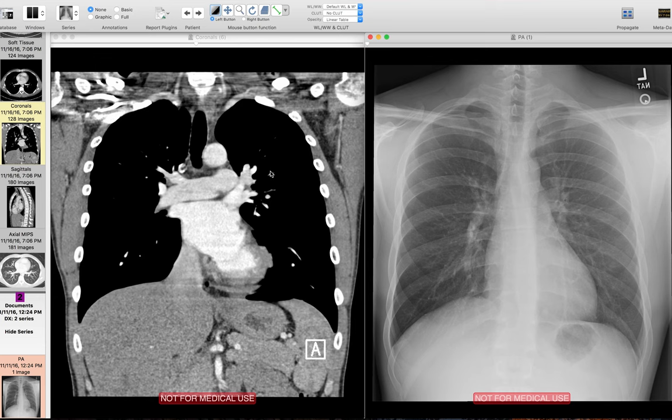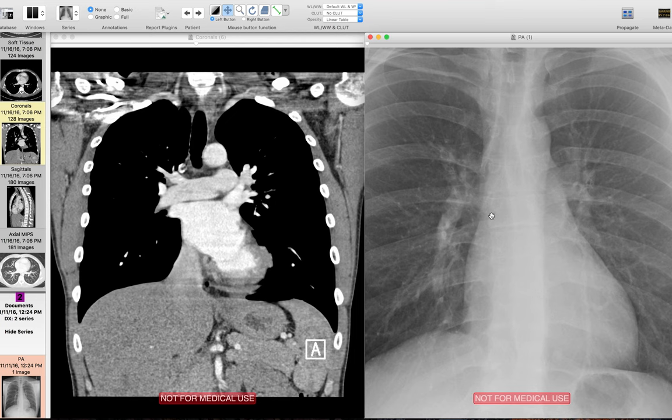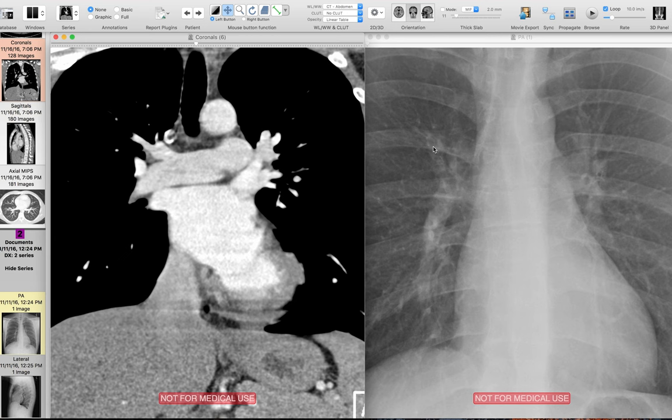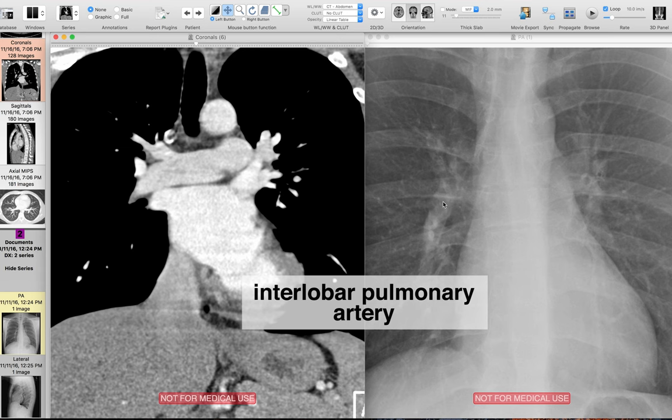Let's start out with the right hilum by zooming in a little bit so we can see the structures better, along with the corresponding CT. The right hilum has this characteristic boomerang shape, and the inferior part of this boomerang is the opacity that contributes the most to the hilum — it's the right interlobar pulmonary artery. This artery divides off and supplies the middle and lower lobes.